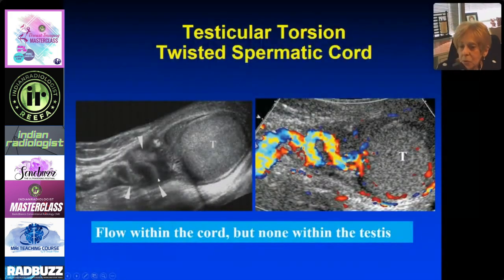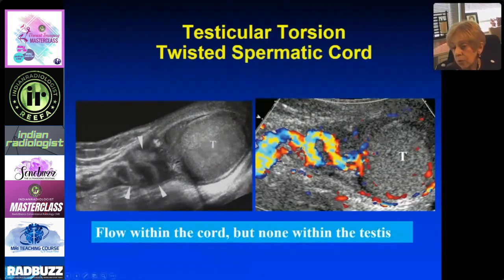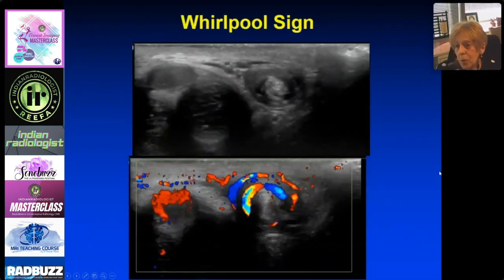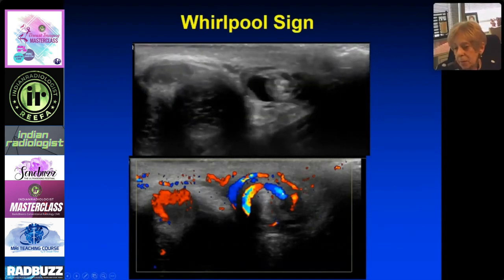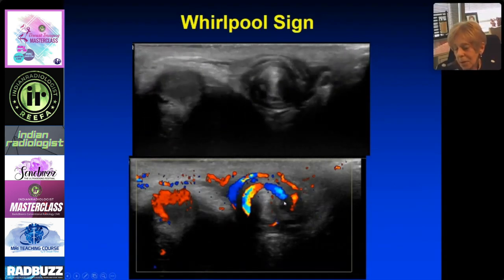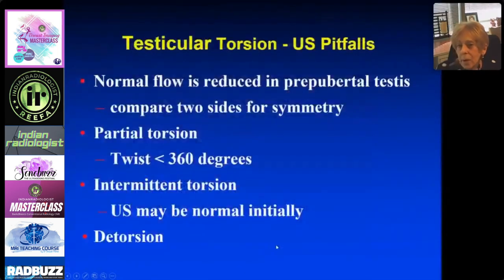Look at the cord — here's a twisted cord. With color Doppler you may see flow in the cord because the twist is just below or involving part of the cord, so blood gets engorged. The whirlpool sign on color Doppler looks almost like an intussusception — a swirling pattern that confirms the twisted cord and torsion.